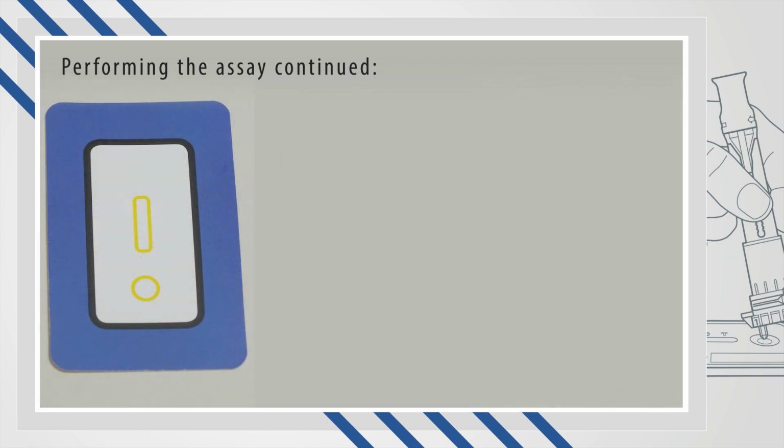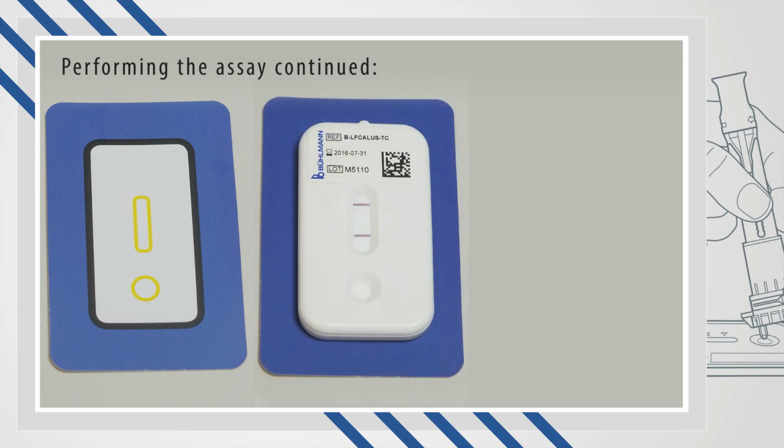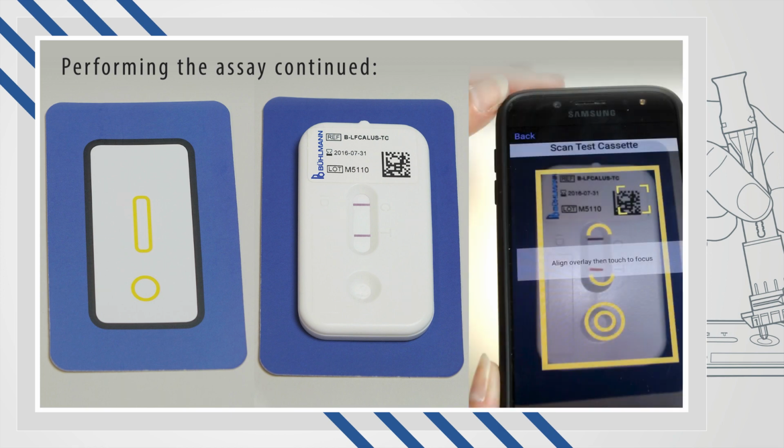Once the alarm has gone off, place the test cassette on the reverse side of the camera test card. The cassette must be on the blue card provided, as the app uses the contrast between the blue and the white to locate the test correctly. Overlay the yellow outline on the app with the corresponding shape of the test cassette.